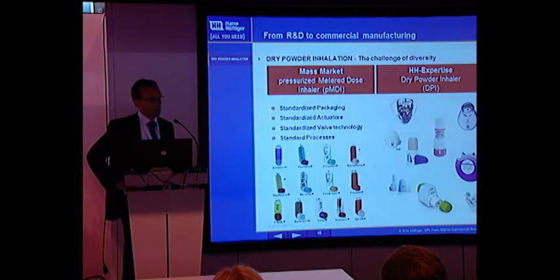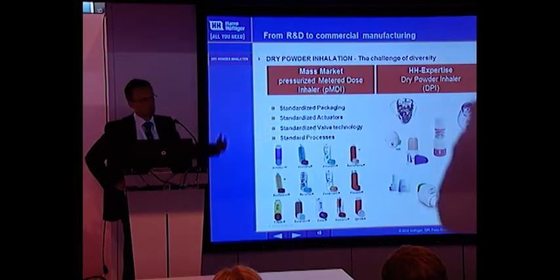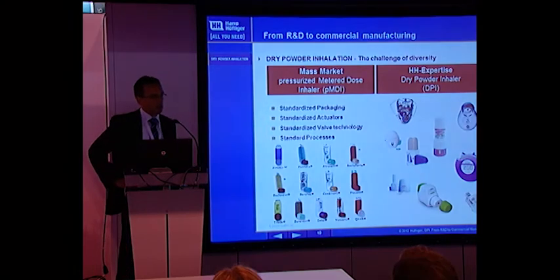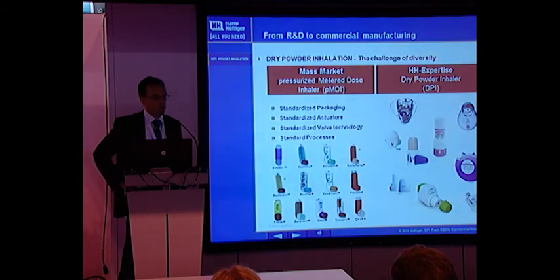Dry powder inhalation, and I've shown some dry powder inhalers on the right-hand side. You see already this is very diverse, and it's really a challenge also for the generic industry to cope with so much different technology available in the market and to choose what should be the right technology for my generic version of Seretide, for instance.